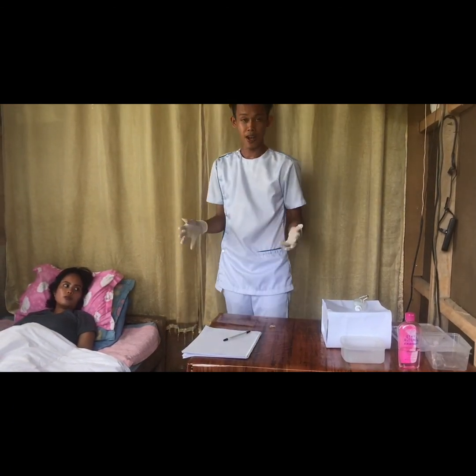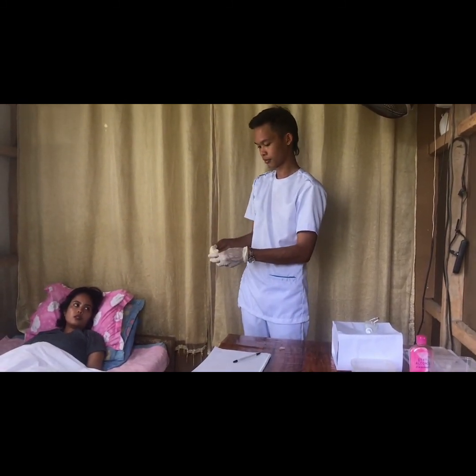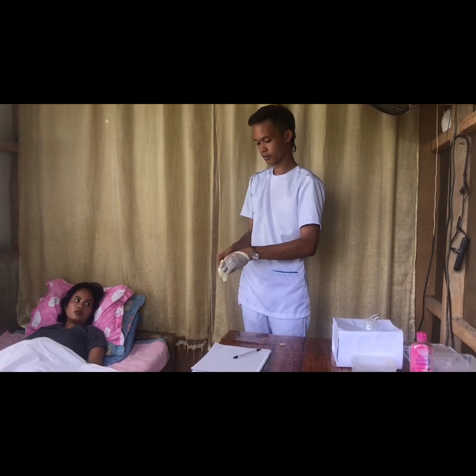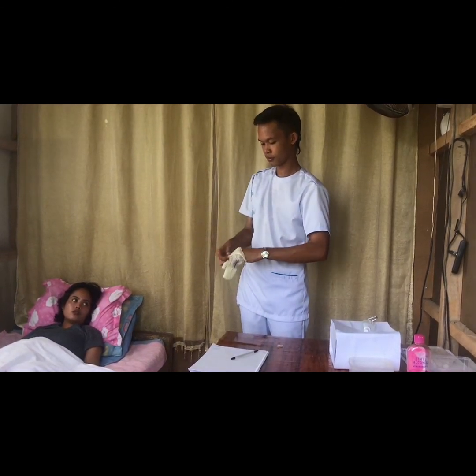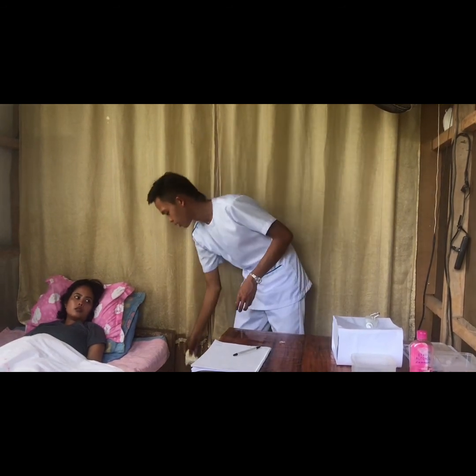Okay, so after that, we're going to remove the sterile gloves that we have. Going to dispose of this. So that's all for the catheterization for both female and male. Thank you.